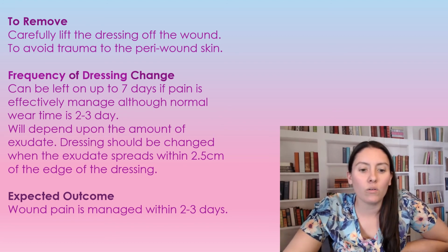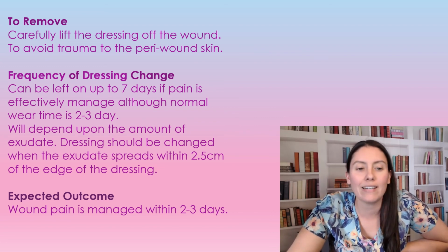The expected outcome is that we have wound pain managed for 2 to 3 days. That's all I have for this video.